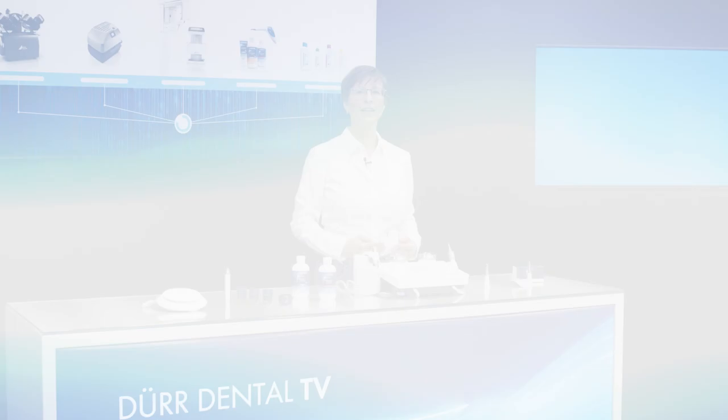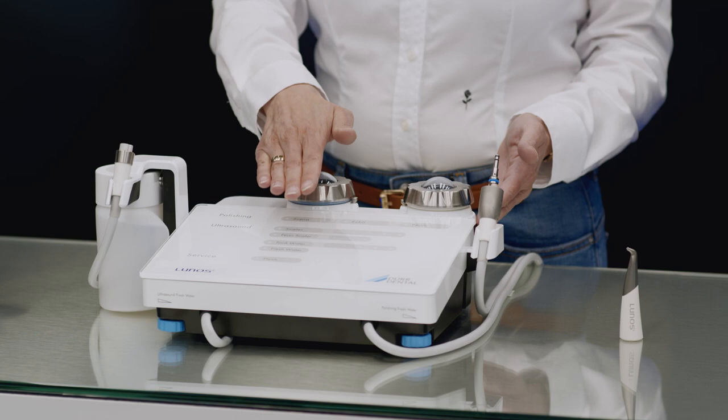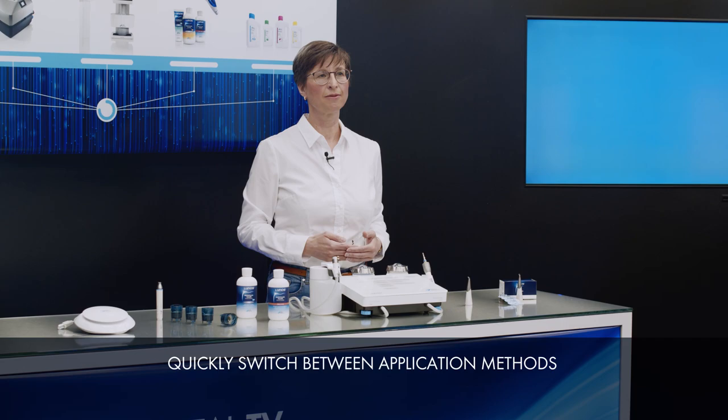In just a single device, the MyLunos Duo brings together several functions that can be controlled quickly and intuitively using the touchscreen display, the settings dials and the 360-degree foot pedal. The various application and settings options offer the user a great deal of flexibility when selecting treatment methods. If you need to switch the application method from ultrasound to polishing, for example, you can quickly do this even while the treatment is underway. The power settings or water supply can also easily be adjusted.